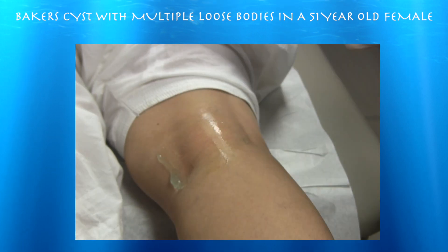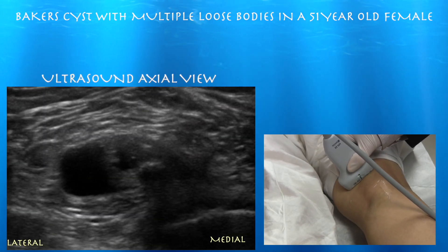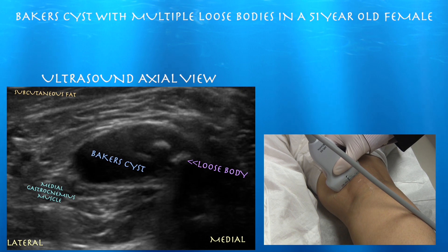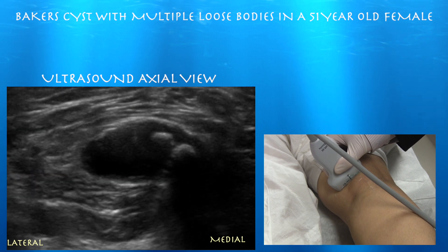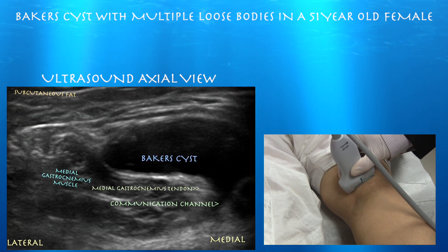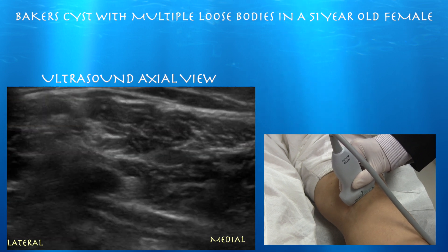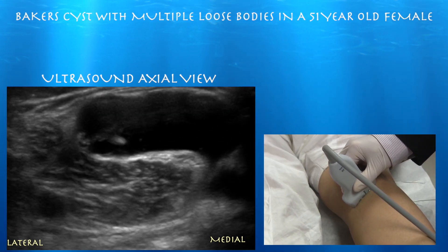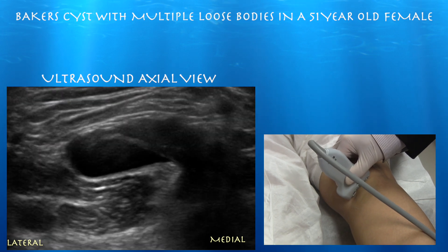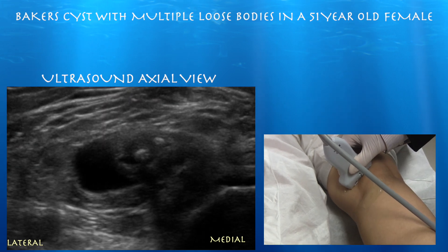Now we're going to take a little axial view. Right side of the screen is medial, left side is lateral. We're starting basically above the cyst, now we're going down. We can see it come into view with those loose bodies. See the communication channel — you can see it right above the medial gastrocnemius muscle. And we're coming up — here's a nice view of that channel as it comes up. Here's that septum coming across. Sometimes you get a better view of the septum in a different plane. Just keep going proximally and you can see those loose bodies form.